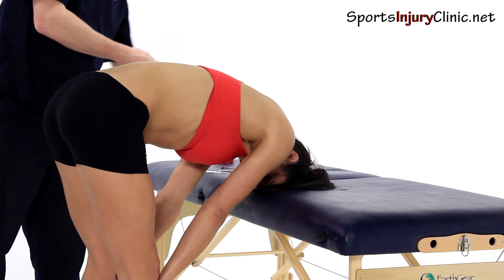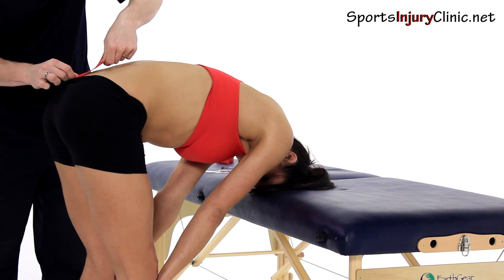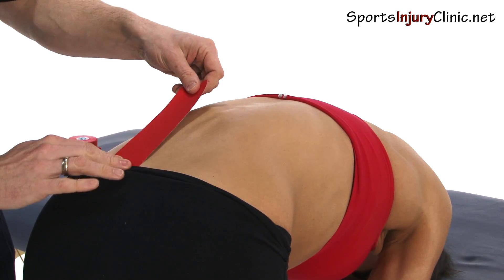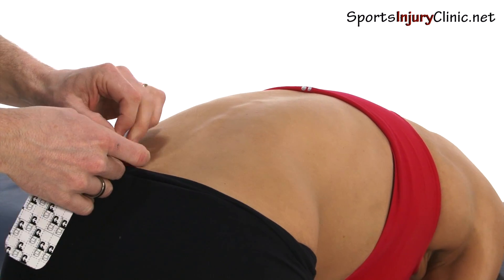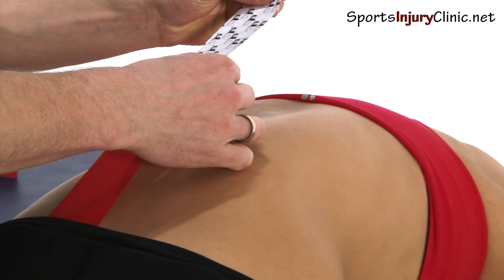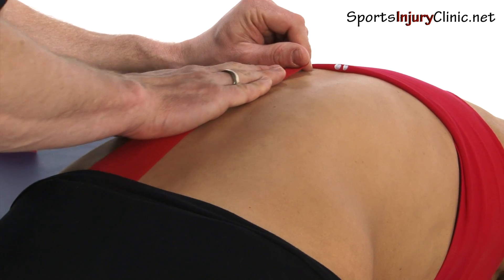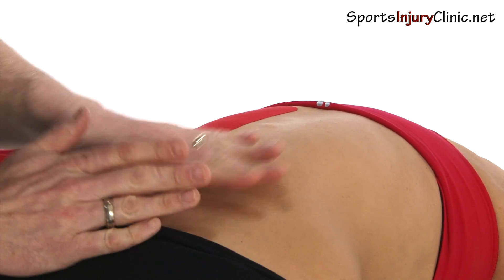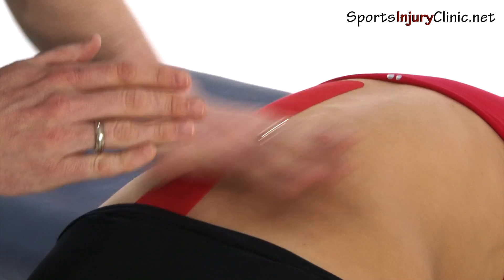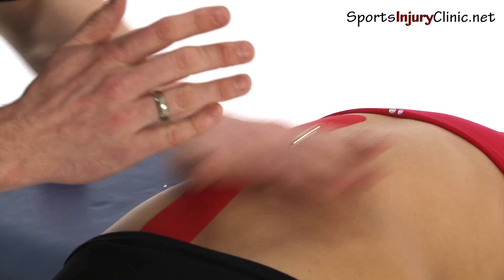We're going to deactivate, so we're going to take off the backing paper. We're going to put it at the base of the muscle like so. The base has got no stretch on it at all. I'm now going to apply a 50% stretch up the back extensors, and it's important to activate the glue so it sticks better, because you're probably going to use this for sport or walking around and you want to make sure it stays on. So that's one.